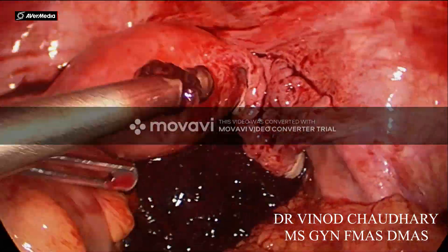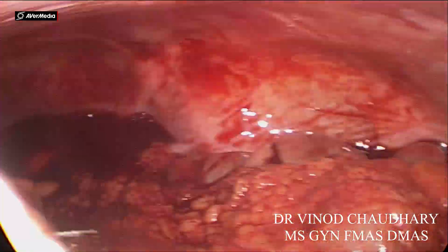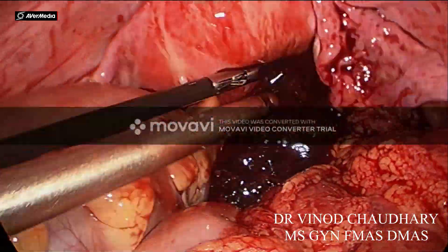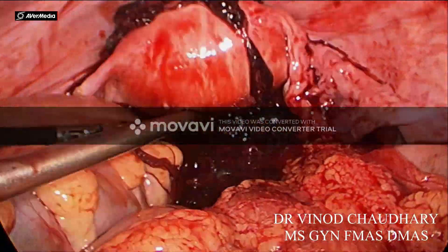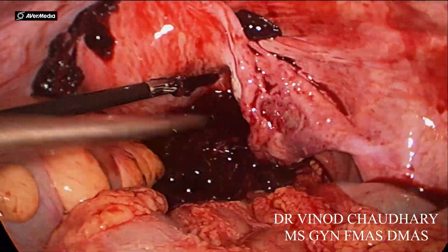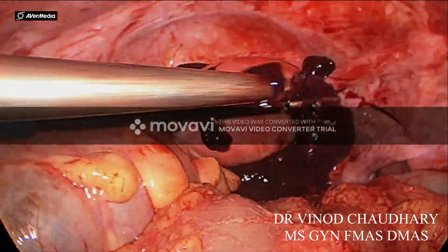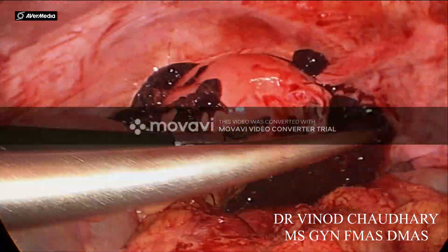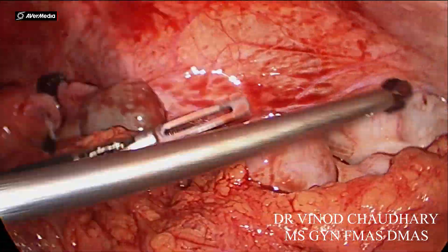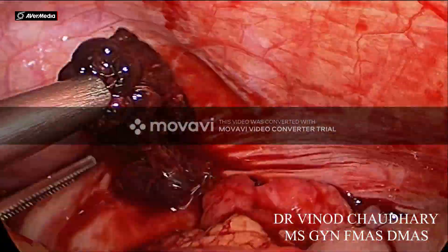Now you can see it is gradually decreasing in size. There is also blood in the paracolic gutters. It seems like it is almost over — only some part is left. These are the last remaining clots.